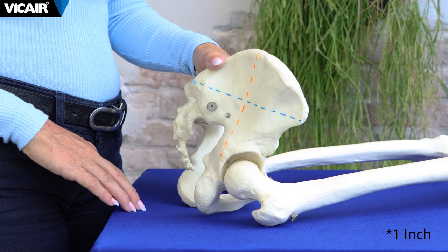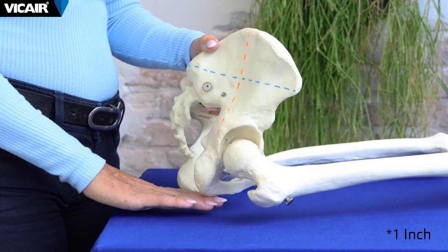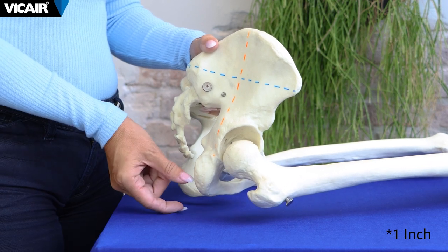To ensure that a person is not bottoming out on a cushion, a minimum clearance of 2.5 centimeters between the ITs and the bottom of the wheelchair cushion is required.